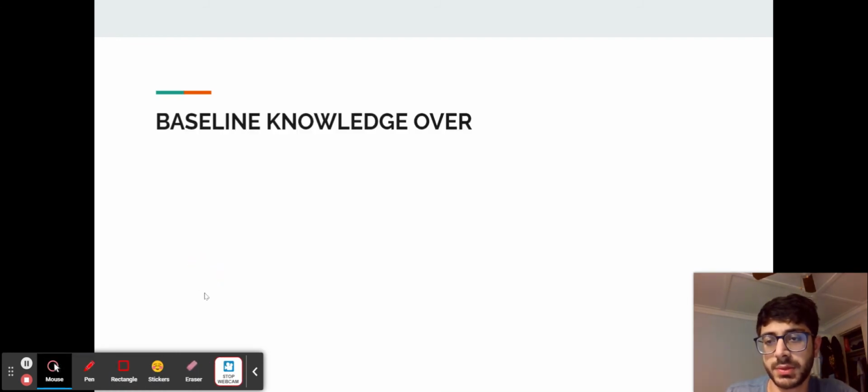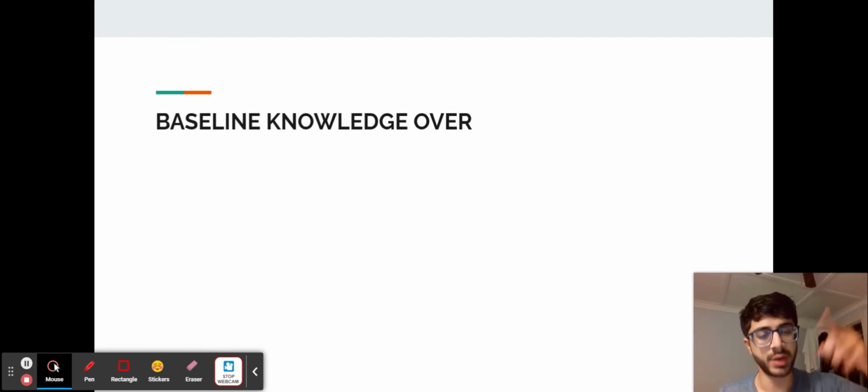Okay, next. So this is all the baseline knowledge that you need moving forward. But I'm not going to end the video here. I'm just going to add some other stuff, some actionable information. Now that you know what a deflection means and you kind of know where 2, 3, AVF are, I thought I'd add an actual actionable takeaway.